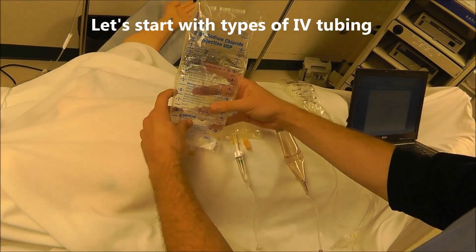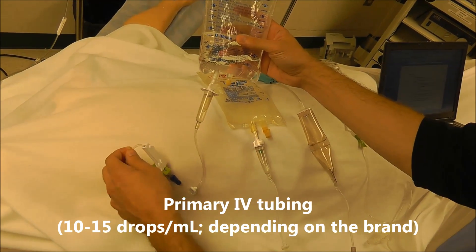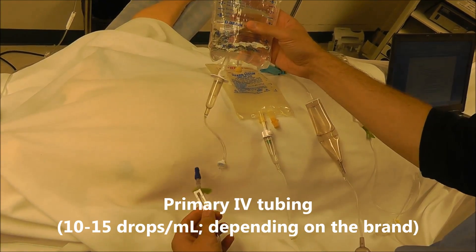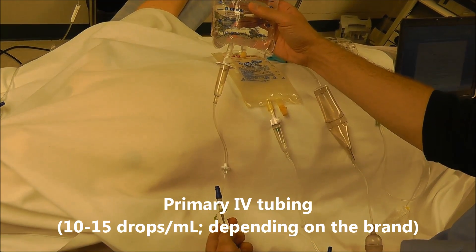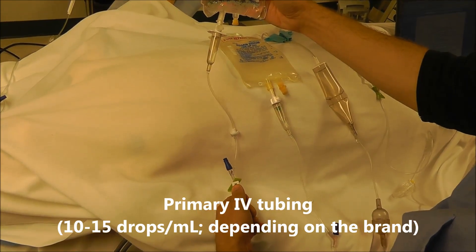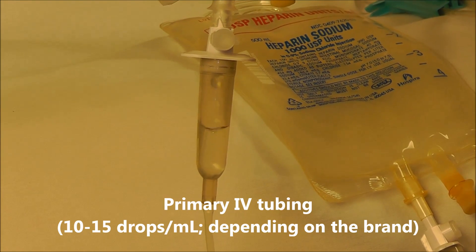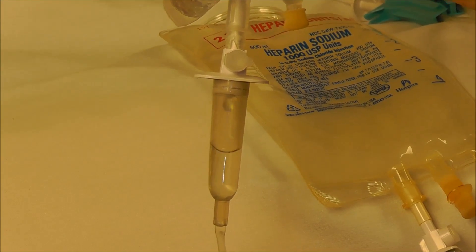The first type of IV tubing I want to go over is primary IV tubing — this is just regular IV tubing and the most common tubing we use for adult patients. I'm going to open the roller clamp here and you'll watch those drops start to come out. It takes 10 to 15 drops to deliver 1 cc of fluid to the patient.